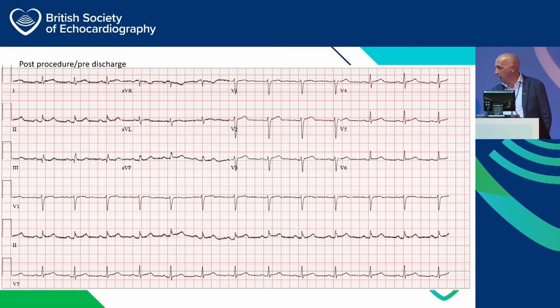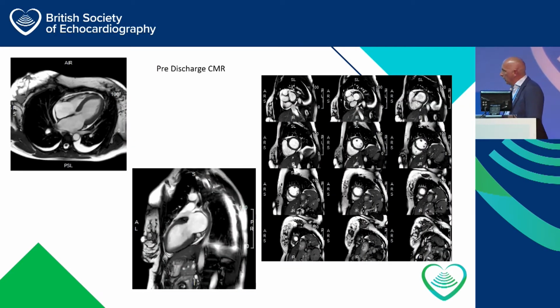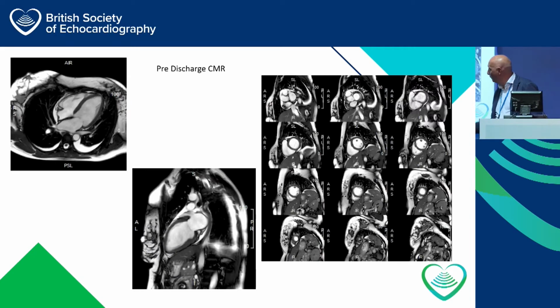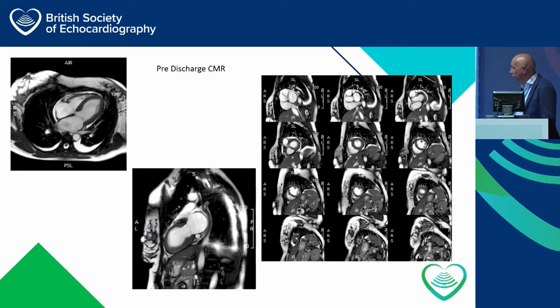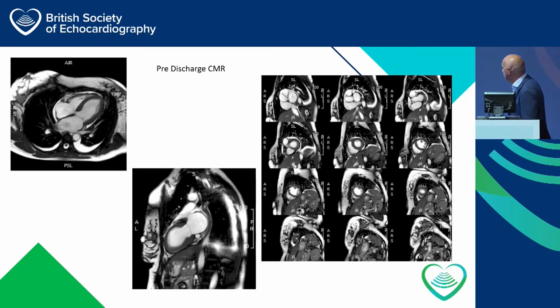I know this is an echo meeting, but everybody shows CMR pictures these days. And you'll notice that there is no Q wave development on this ECG either. Yeah, it's important. So this is her cardiac MR. I am not an expert in MR, but I know that's a 4-chamber, and I know that's a 2-chamber, and I know this is a short-axis stack that we can all do on our echo machines now with 3D capability.